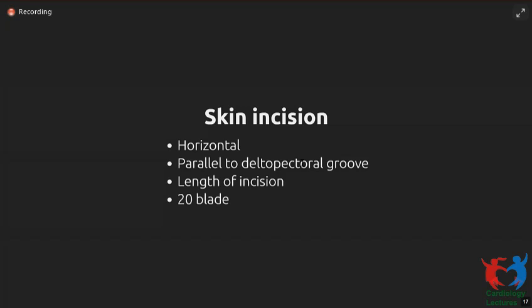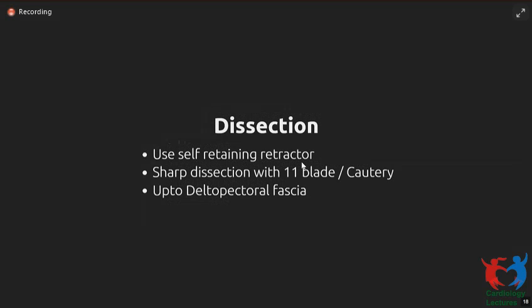You have to plan the length of incision beforehand. It varies quite a lot depending on the device. If you use a Medtronic single chamber device, the current devices are very small, and an incision of about 1.5 to 2 finger breadths is sufficient. A lot of these things it's good to think of in finger breadths, or you should know what 2 of your finger breadths are. Like I know 2 finger breadths is going to be 3 centimeters. So like that you should probably know because it's very easy to measure that on the table. So depending on whether you're going to put a single chamber pacemaker or a larger ICD, length of incision may vary. And this I've already discussed.